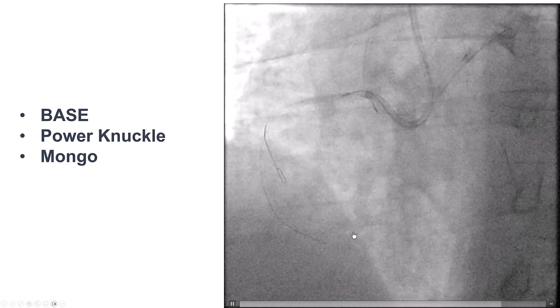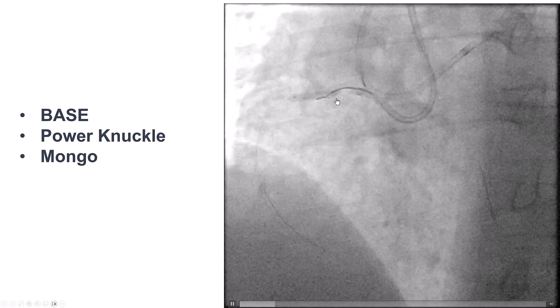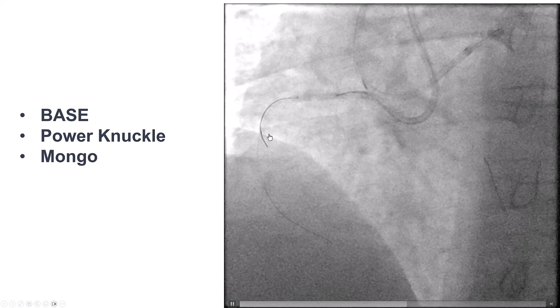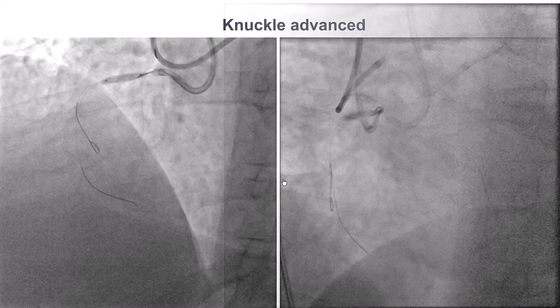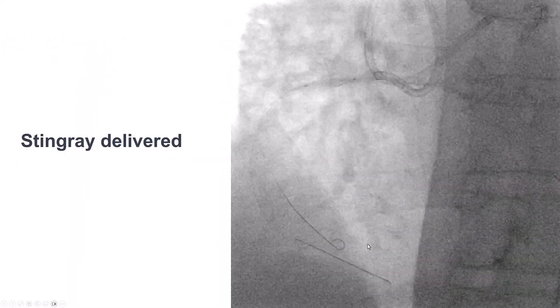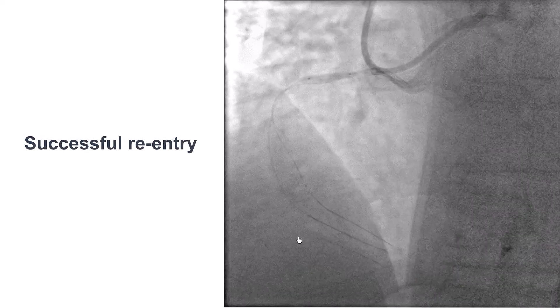We then thought we could perform the dissection in the antegrade direction. We used a form of the BASE technique — balloon up for hemostasis with a microcatheter alongside it — and advanced a Gladius-Mongo wire into a different plane more consistent with the right coronary artery. This was confirmed on contralateral injection. We then performed very short, small deflations of the balloon and delivered the stingray balloon further distally.